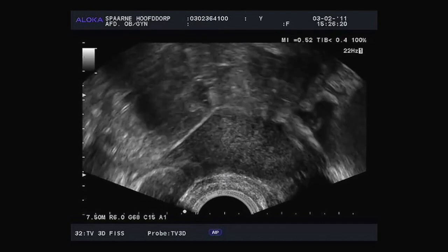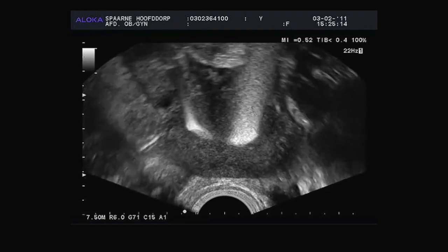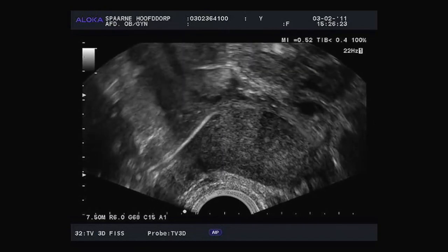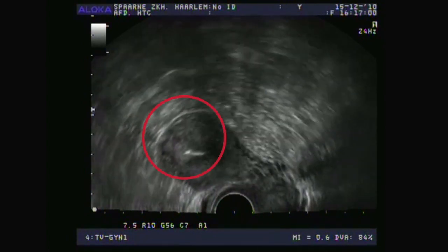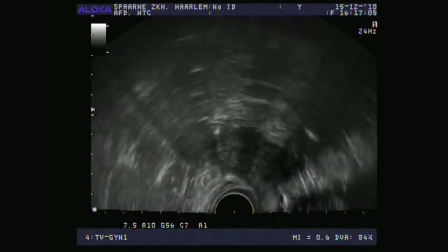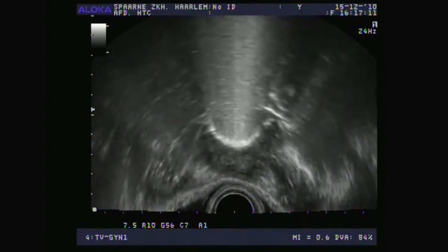Here are some ultrasound images. Can you assess whether the fallopian tubes are open? Let's look at these images again more closely. This view is from the bottom upwards. This is the ultrasound transducer, this is the woman's uterus, and this is the abdominal wall, and this is the woman's back. I inserted only a tiny little bit of the foam and you can already see that it flows straight to the fundus. Now I'll turn the probe about 90 degrees from a longitudinal cross-section to a transversal cross-section.